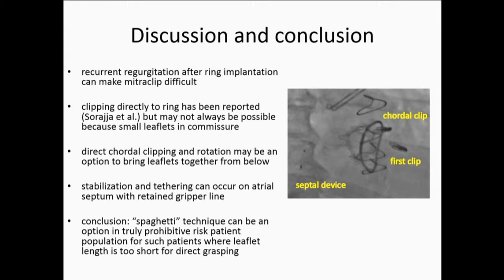All right, so Samir, you win the I Got Guts award for this afternoon, because intentionally wrapping a clip in the cords, spaghettiing, is, boy, that takes a lot of guts. Well, I think the biggest thing, the surgeon saying that he would go ahead and replace, and I said, all right, so we have full carte blanche to do whatever we want.